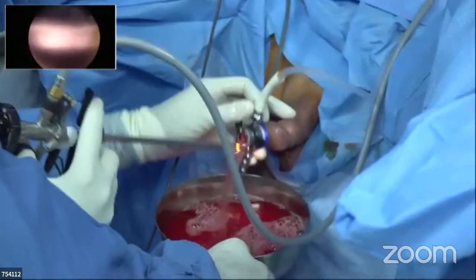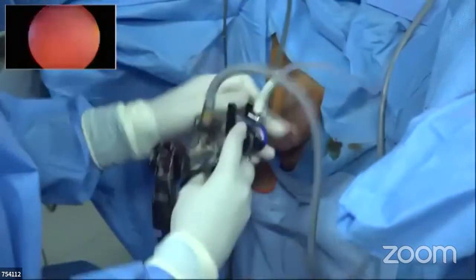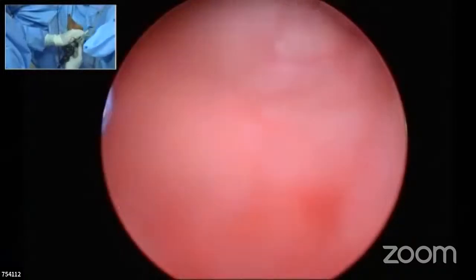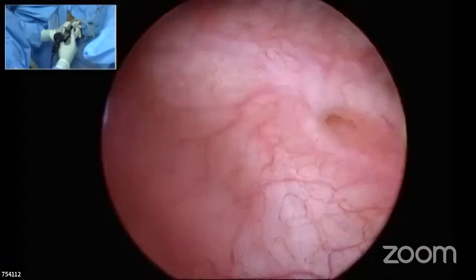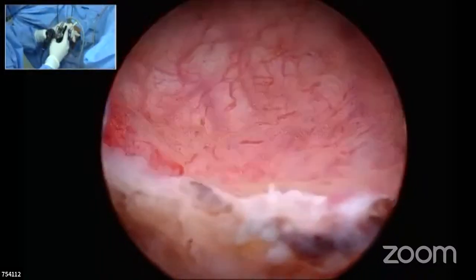Everybody has their own way of doing it, but I think I've done the resection. My hemostasis is fairly decent. The urine is quite clear. At the end of the resection, I look for any chips inside. I'm going to do an evacuation now because there are some chips there. And I'm going to look at whether I have preserved the ureteric orifices. Yes, the left and right ureteric orifices are preserved, and a fair amount of trigone is left behind.